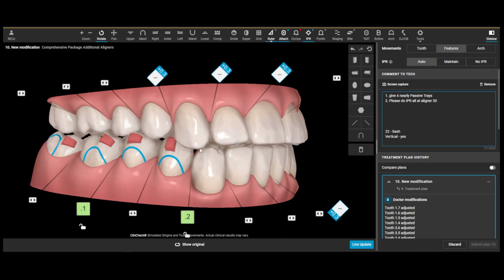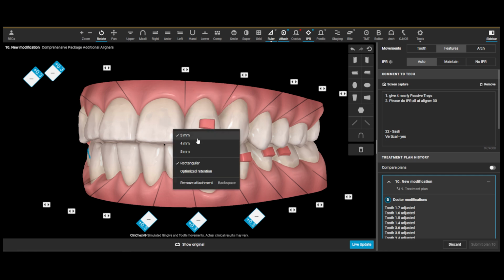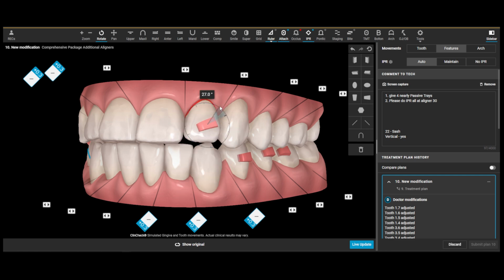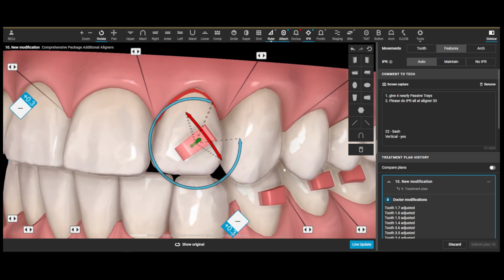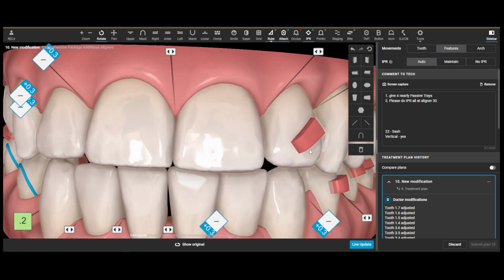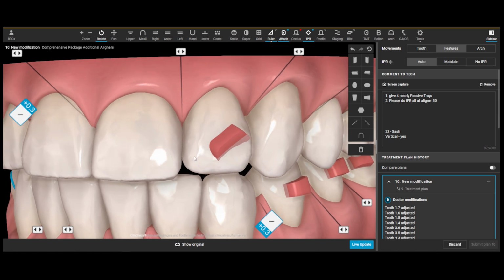So our upper lateral incisor on the 2-2, we wanted to place a sash attachment. That's this guy. We'll click it to 4 millimeters. We move it so it's at a 45-degree angle. All right, 45-degree angle. And now we can grab this and we bevel it, we drag it towards the gingiva. There we go. So now this is the pushing surface coming from the gingival.